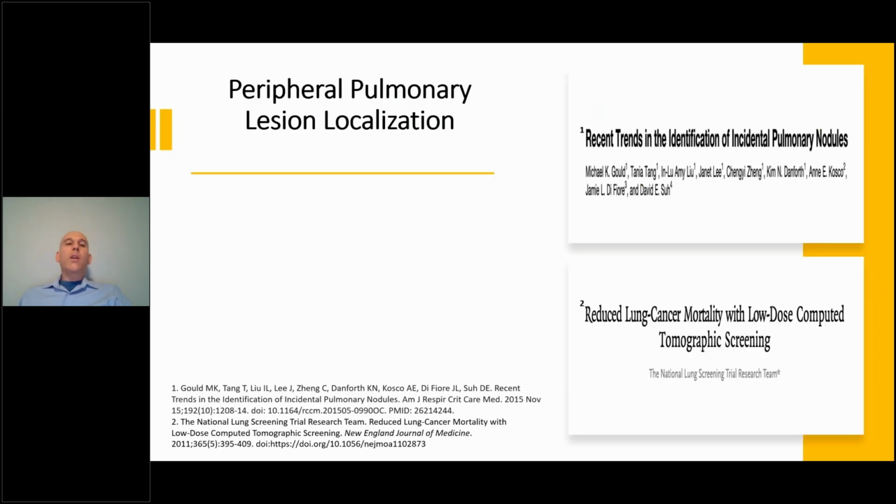So now that we've talked about some clinical evidence for using the ILLUMISITE system for diagnosing and biopsying lung nodules, it's important to start thinking about not only diagnosing them, but what about localizing them? It's a suspicious nodule. It's been followed up over years. It's slowly growing. It's malignancy until proven otherwise. Or there's a patient with concern for clear oligometastatic disease. So not everything requires a biopsy. Sometimes it requires maybe a localization procedure, either instead of a biopsy or in addition to a biopsy, in order to help facilitate the next steps.